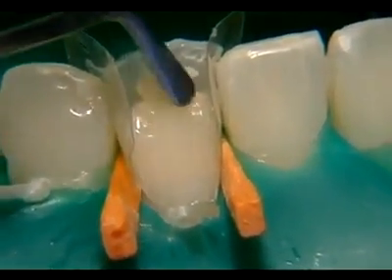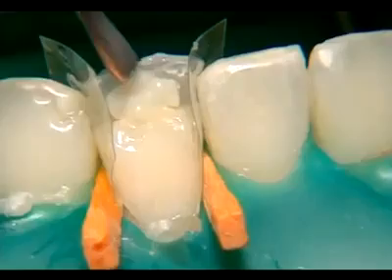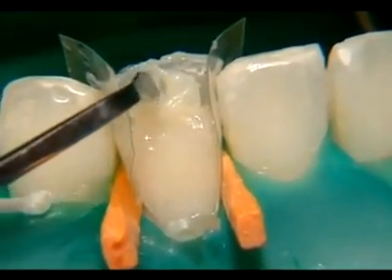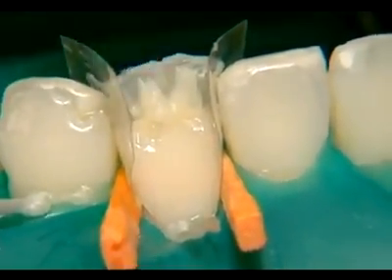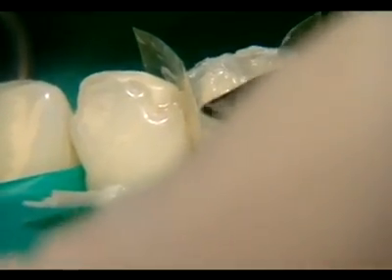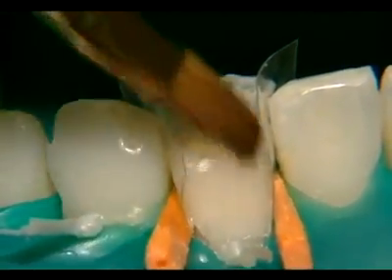Next, the dentin material is applied, and the mamelons are shaped. If several layers are used to fabricate the dentin core, each layer should be light cured individually. The dentin core is polymerized.